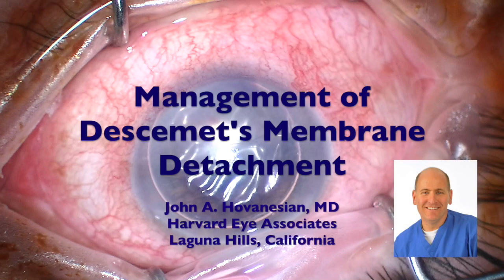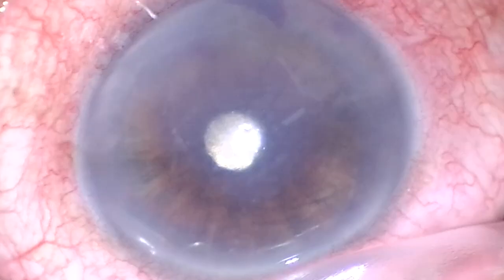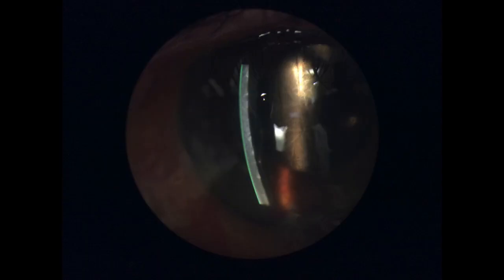I'm John Hovenessian. In this video, we're going to review how to manage a Descemet's membrane detachment. This is a patient who had cataract surgery with a goniotomy that was complicated by a detachment of Descemet's membrane that was not detected during surgery, but found the next day when the patient had significant corneal edema.